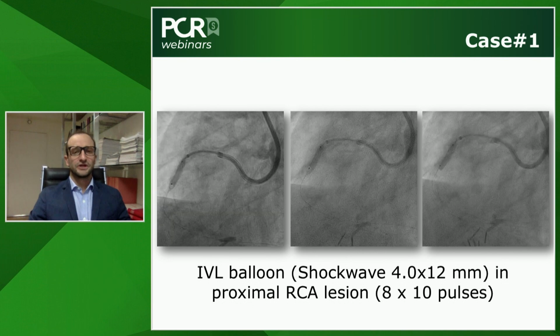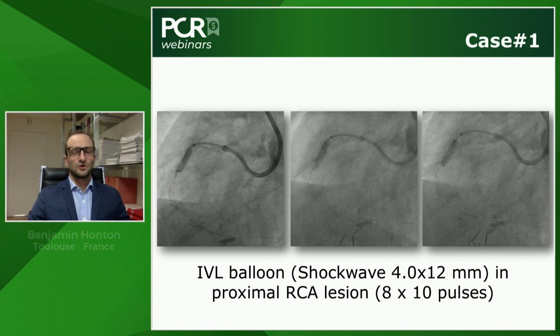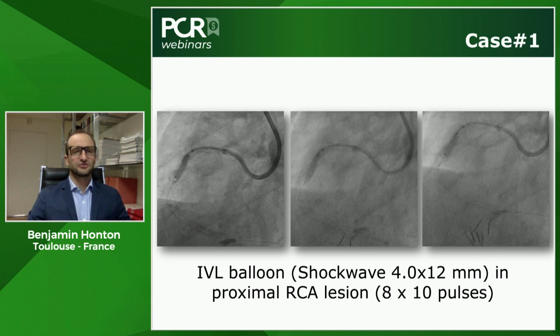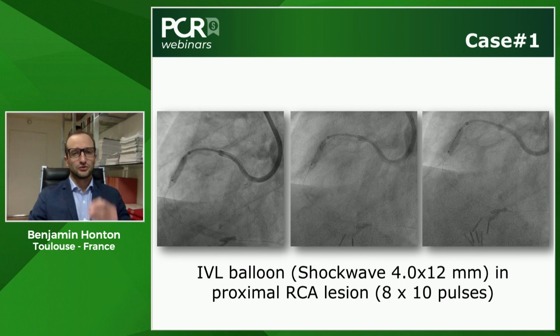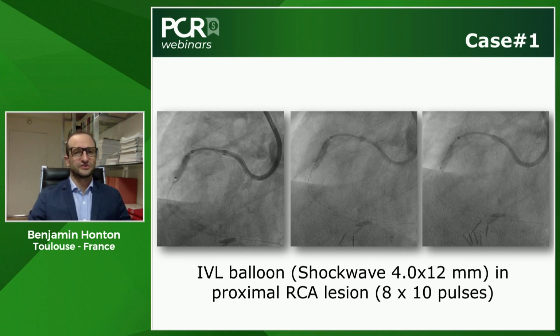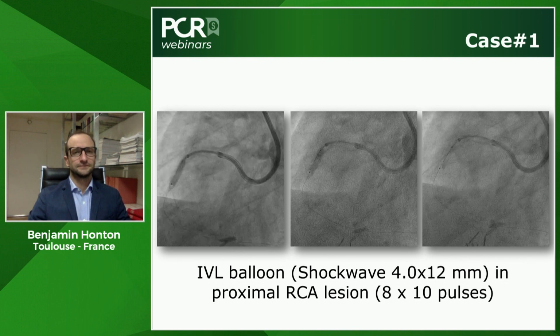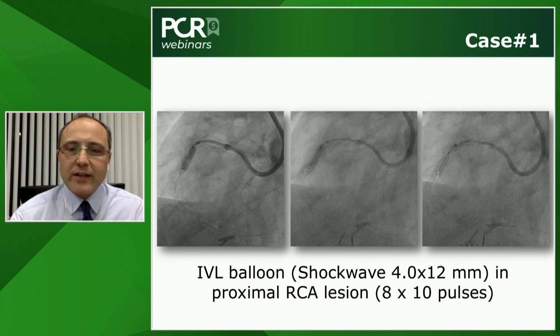No, I absolutely agree with Michael. It's case-based. On a critical lesion, it's mandatory to predilate, as we have in the CAD study. You can use a 2 millimeter balloon, and most of the time that allows the crossing of the IVL catheter. Thank you very much. Please, Michael, let's see further your case.